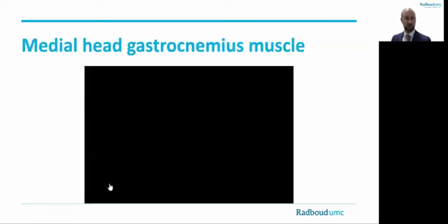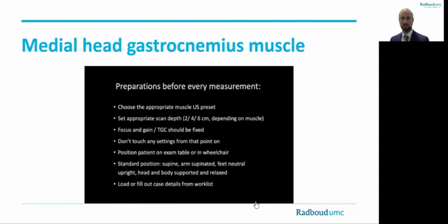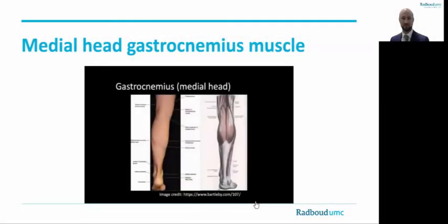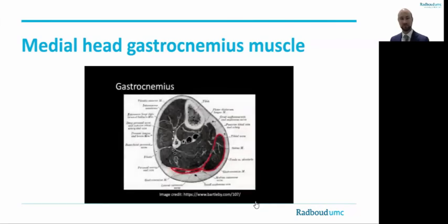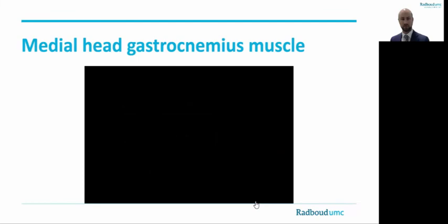Let's continue with our last muscle — the medial head of the gastrocnemius. This is the protocol for scanning the medial head of the gastrocnemius muscle. The subject is in a supine position with the limbs relaxed and rotated outward. To standardize the measurements, we scan the muscle at the site of its maximum bulk. For the medial head of the gastrocnemius muscle, this is at one-third from the knee cavity to the medial malleolus. This position is marked on the skin.